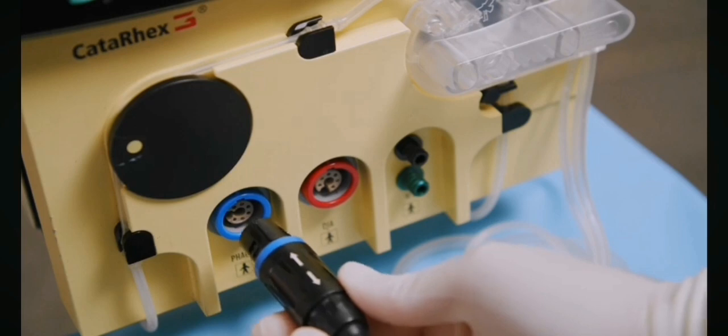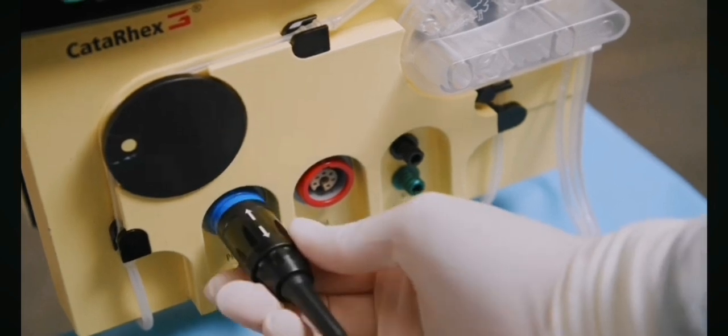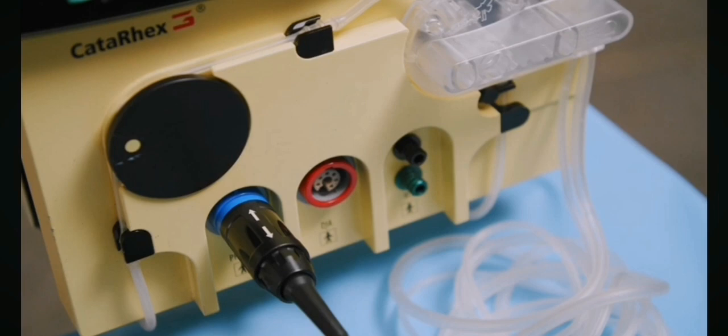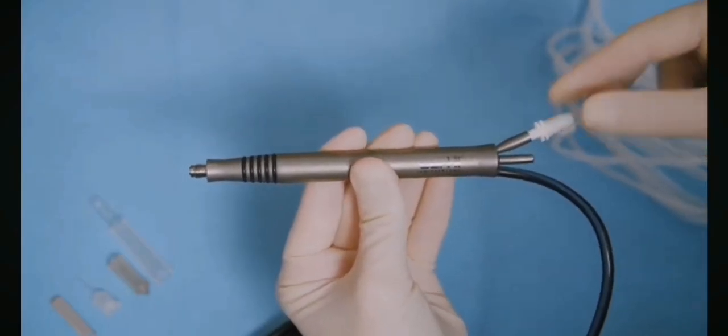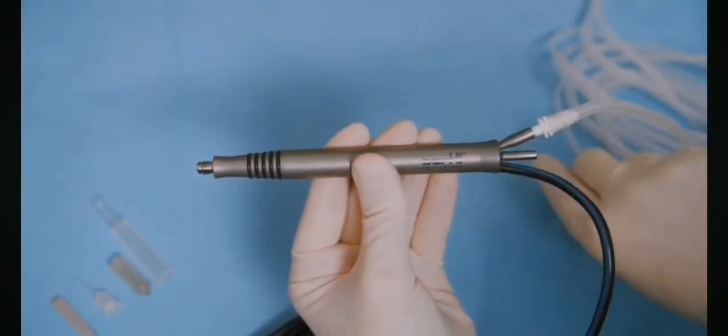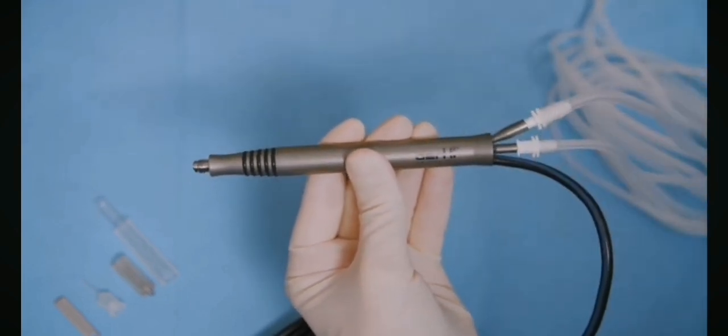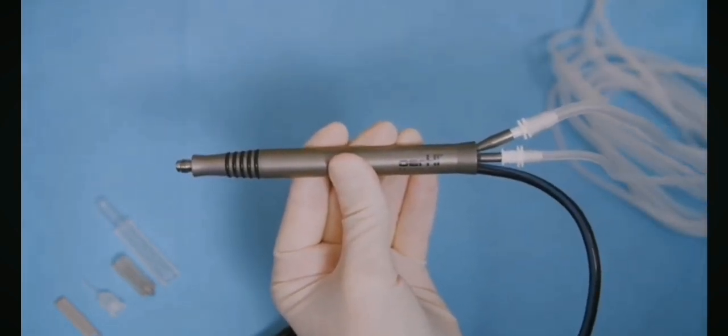Connect the FACO handpiece to the Eartley device. The FACO handpiece has a blue ring that matches a blue ring on the machine. The arrows must be visible once connected. Connect the irrigation and aspiration lines to the port on the FACO handpiece. Make sure that the connections are secure.